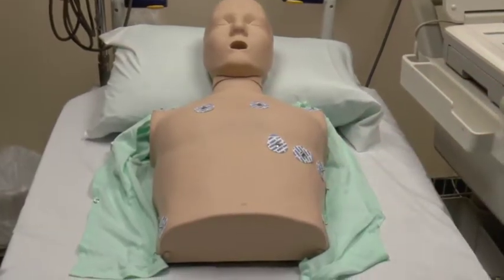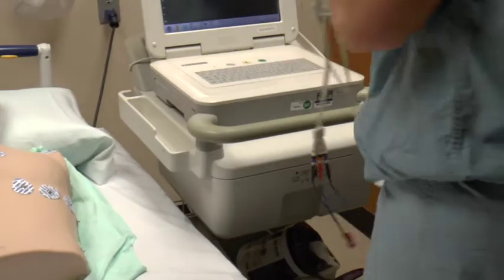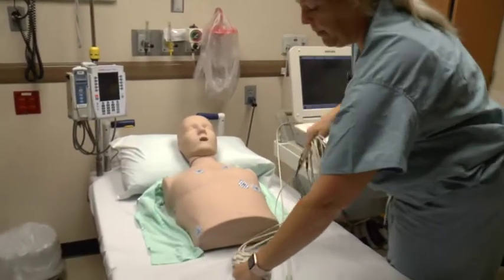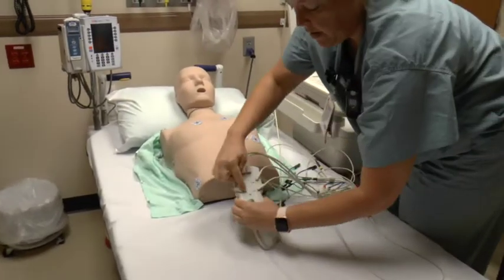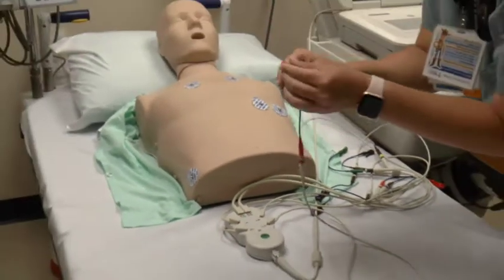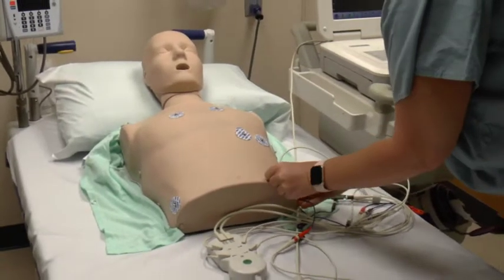That covers all of the placement. Then you'll get your cable cords, place them on top of the patient if the patient allows. They are all labeled: right lower, left lower, right arm, left arm, and then V1 through V6. These are just clamps — you squeeze and connect them to the patches.